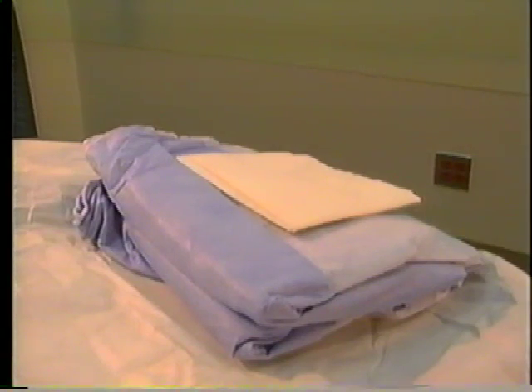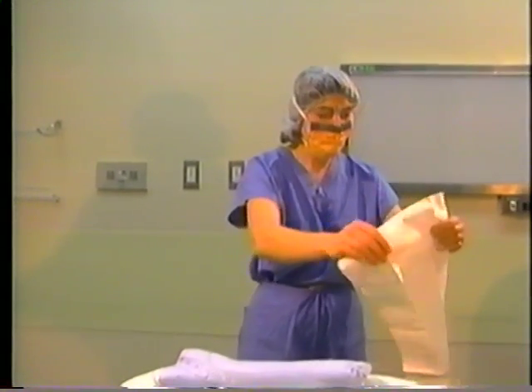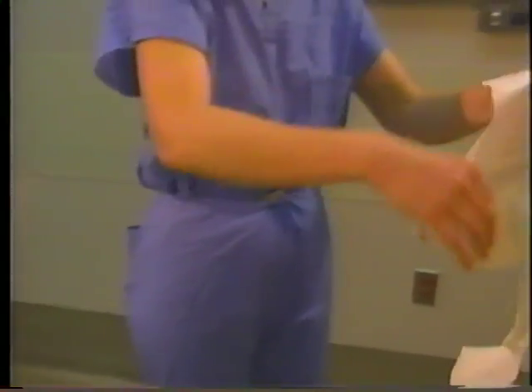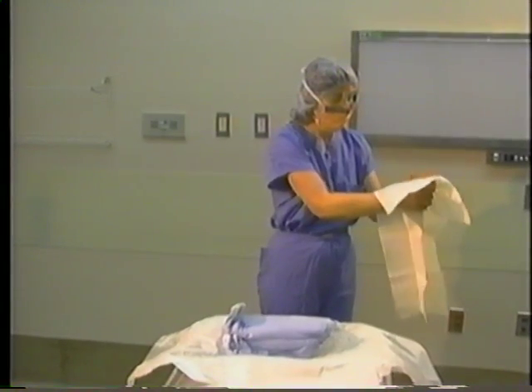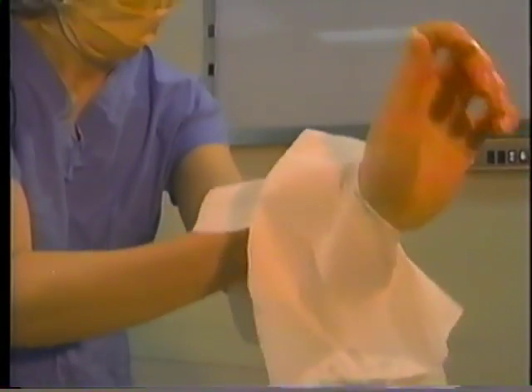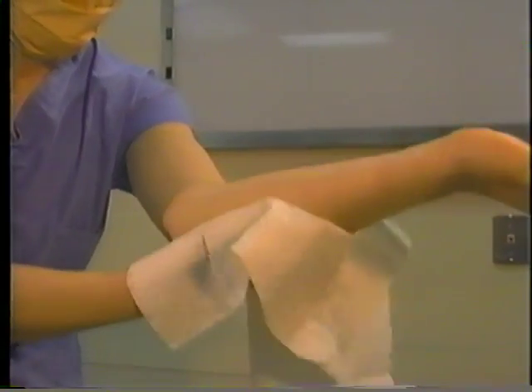The scrub person will pick up the sterilized towel without dripping water on the gown and move away from the table. Keep the towel away from the non-sterile scrub attire by bending forward slightly. Hold up one end of the towel and let it open full length. Use 1/2 of the towel for one hand and arm, drying the hand first. With a rotating motion of the arm, pat the skin up to 2 inches above the elbow.